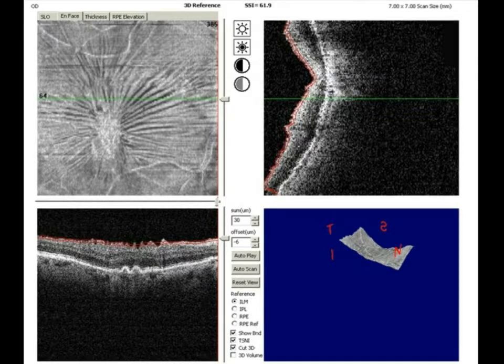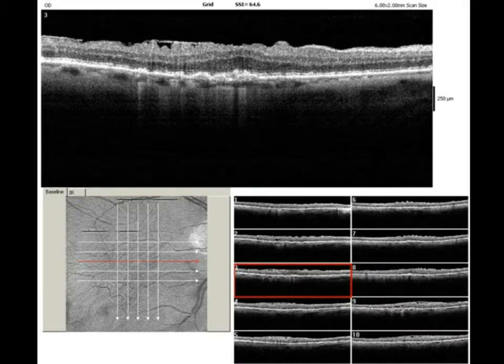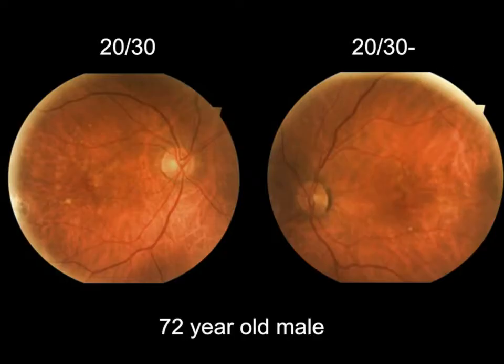When you just simply take a higher mag view of those retinal cross-sectional views, you can see exactly where the drusen is and where the epiretinal membrane is, and you can follow these individuals over time. So we've explained the decrease in best corrected vision in one eye versus the other eye. But why else would we scan our macular degeneration patients on a regular basis, depending on levels of risk? It's usually every year, every 6 months, or for some individuals even more so than that.